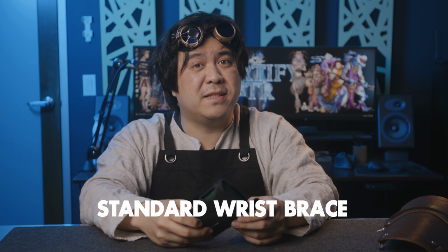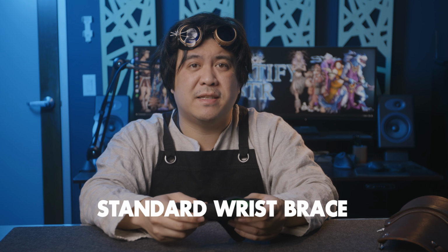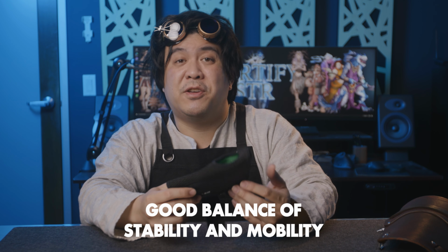These are typical braces that you can wear when you're working and may also be able to use as a night brace if you aren't super sensitive to how things feel. They have a good balance of stability and mobility as well as good comfort.